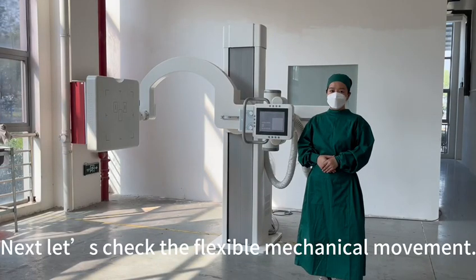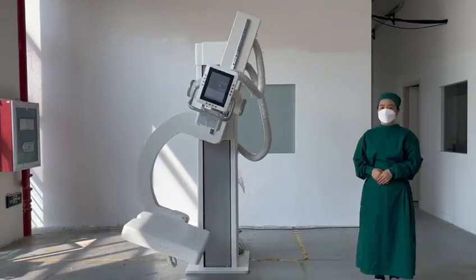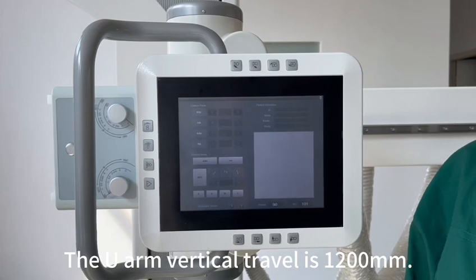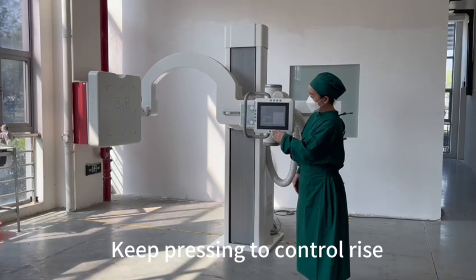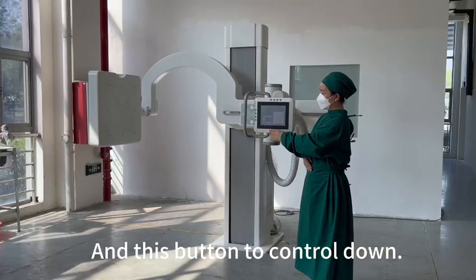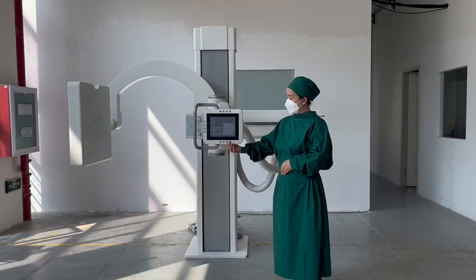Next, let's check the flexible mechanical movement. This is patient standing position — press and hold for three seconds. The U-Arm vertical travel is 1,200 millimeters. Keep pressing to control rise, and this button to control down. This is sliding left, and sliding right.